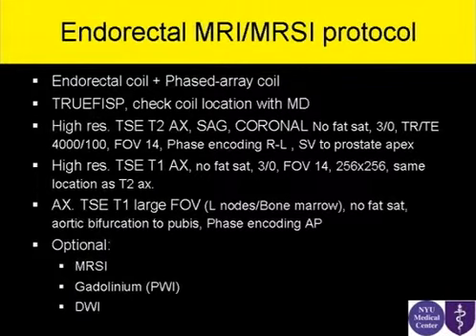I would say approximately 2 to 3% only of our patients get spectroscopy because of reimbursement issues. We do probably 1 or 2 cases a week, approximately. But we do more without spectroscopy. So for the heavy protocol, the endorectal protocol, we use a combination of the pelvic phased array wrap coil with the endorectal coil all together.